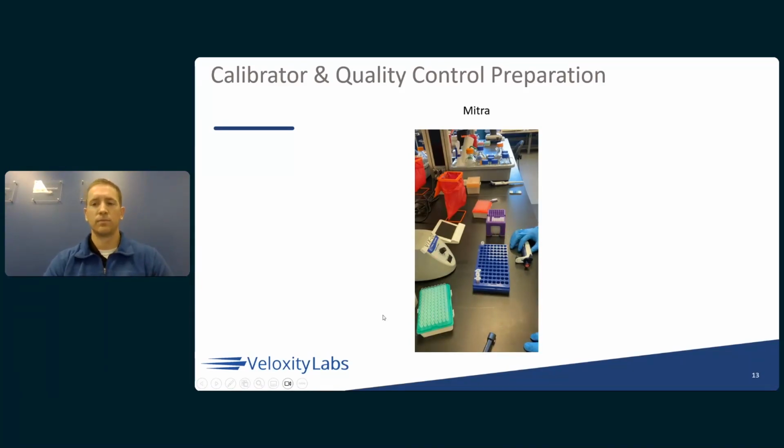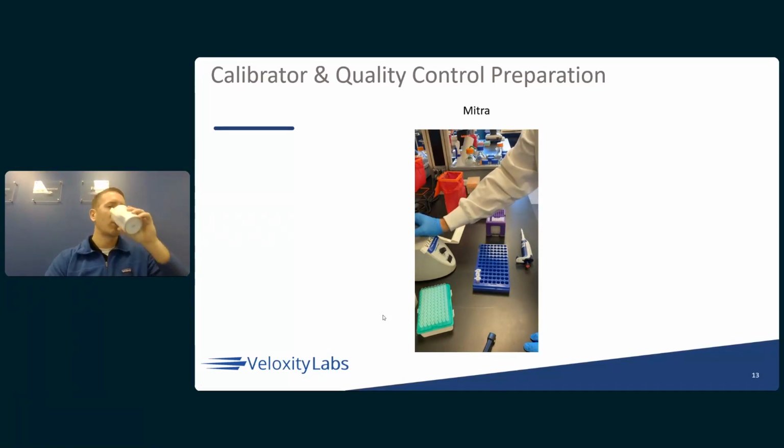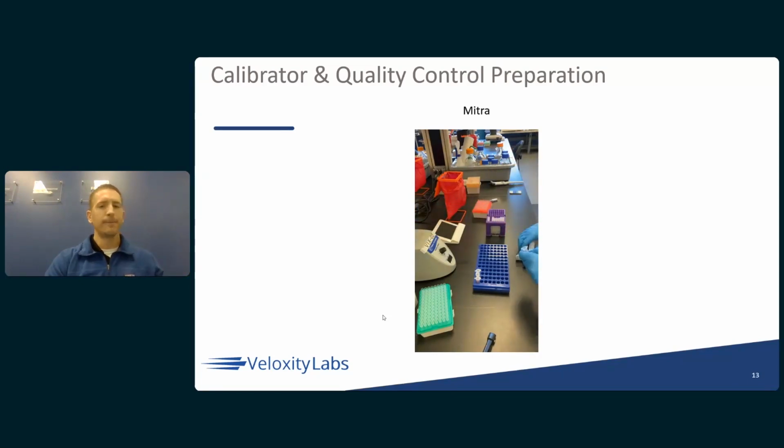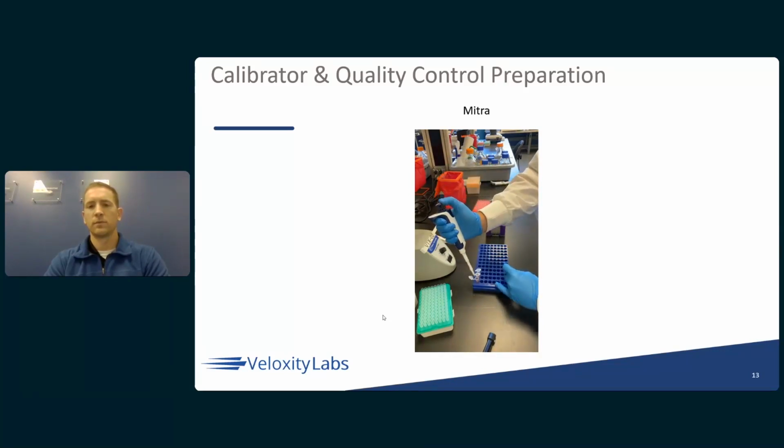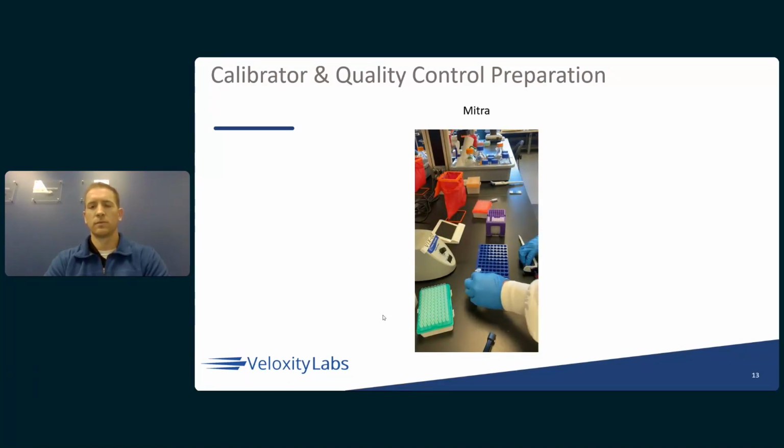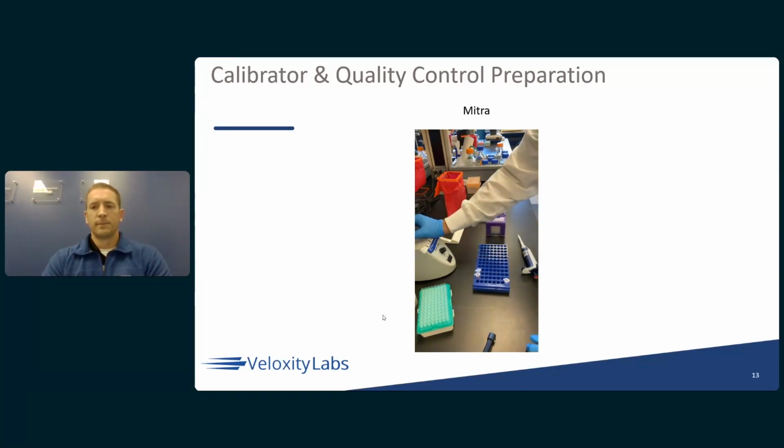When preparing standards and QCs for microsampling, you're first going to take your analyte in solution and spike it into the matrix, which in this case is human whole blood. So we will first fortify our HQC sample by spiking directly into control human blood. And then we will mix that. Typically, we'll allow some time for it to distribute and equilibrate into the whole blood, but for the sake of this demonstration, I'm going to go ahead and move on.